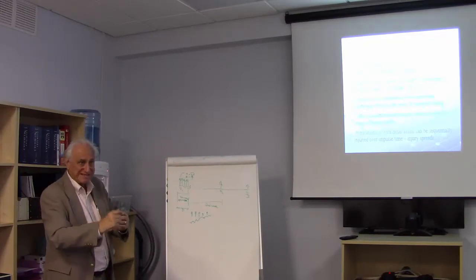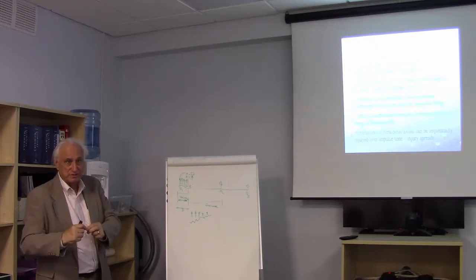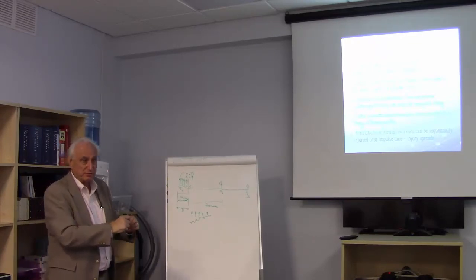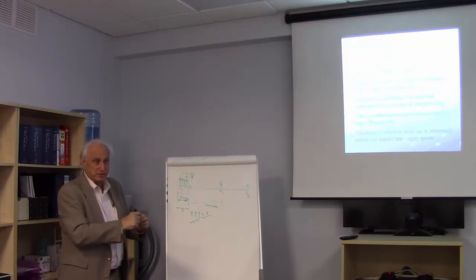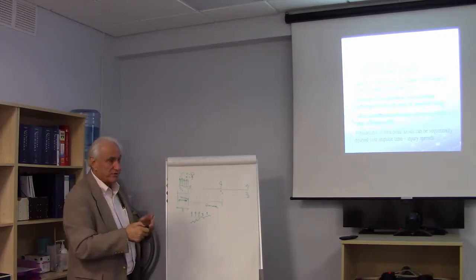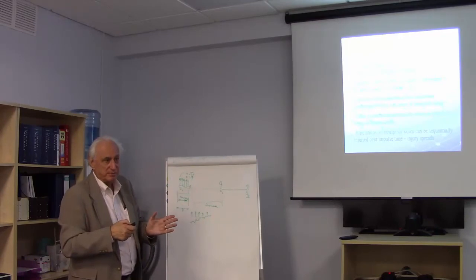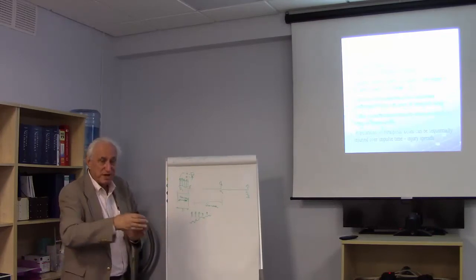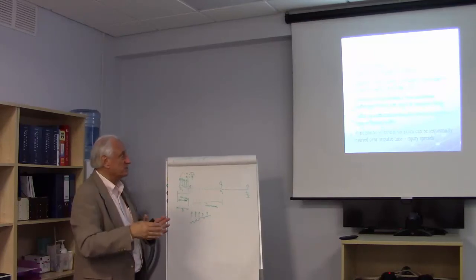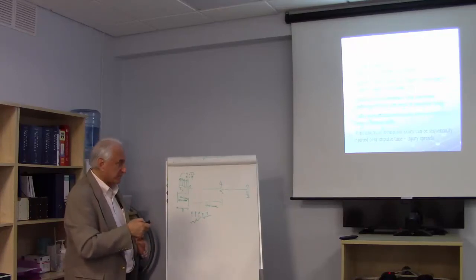That force times that distance into the nerve is the energy being transferred to that nervous tissue, which is therefore disrupting the nervous tissue, and it will produce a different grading of injury. So these are all things you've got to somehow think about, and they're very hard to think about in the operating room because there's a lot of stuff going on, and when you're trying to think about what the injury is, you kind of want to think through this chain of events.